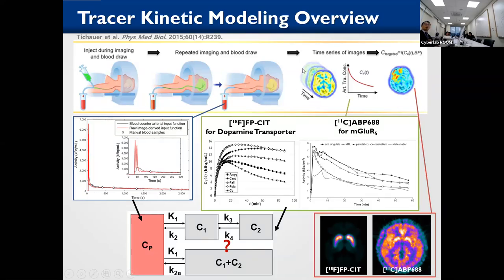And then from dynamic PET images, we can extract a regional average TAC for each region. If we get the voxel TACs, they will look very noisy, because PET data is nothing but counting statistics. So small regions have small counts, which means a very large amount of noise. But if we gather voxels to make big regions, then they are averaged, and they will have a very low level of noise. So the regional curves look very smooth.